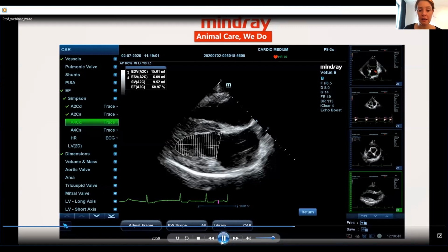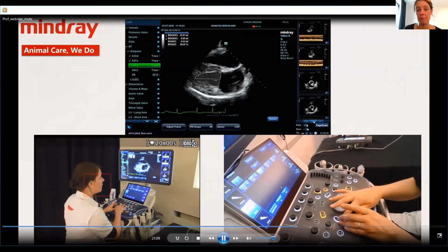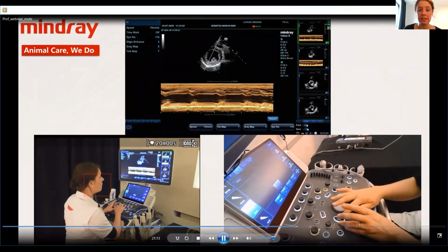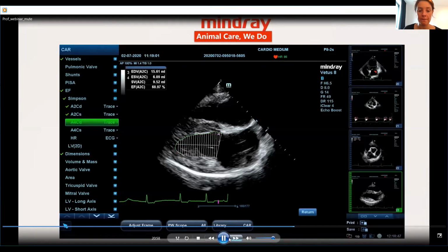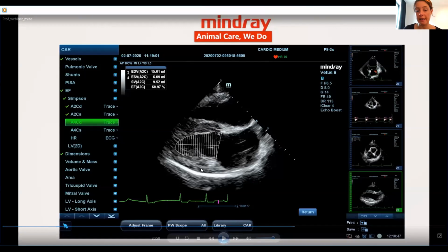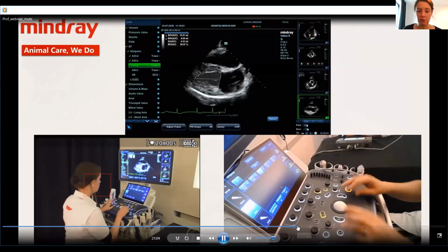Okay, so that is the left ventricular volume in diastole and systole, and the method that we use is the Simpson's method of discs. So what you see here actually is, I will maybe explain it just briefly before we go on to the M-mode image, that the machine actually divides the left ventricular cavity in several discs, and the machine makes a summation of all of these discs and calculates the volume based on that. So it's in your machine, it is also marked under Simpson measurements. Okay. So already a little bit more of an advanced measurement to start with.